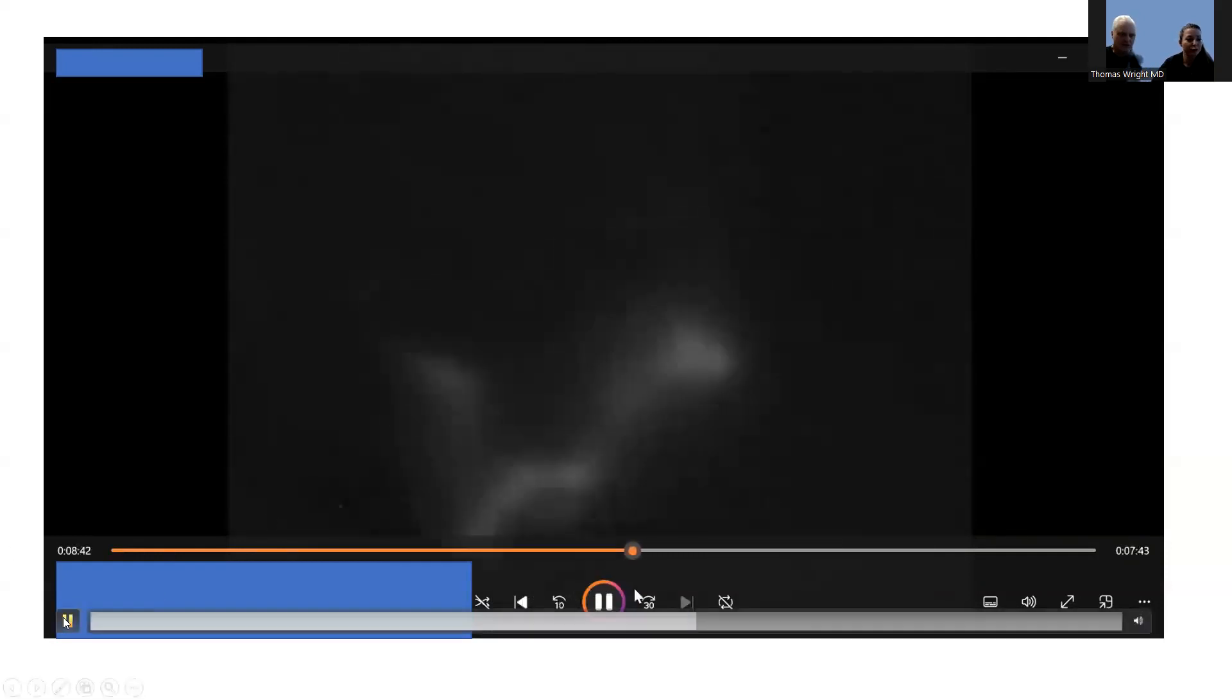Okay. I don't know if I'd say master, but thanks. So the first video I'm going to show you is actually sort of my process of before injecting. You can't quite see this image very well here, it's kind of a dark screen, but it'll get lighter here as you start to see. This is the top of that foot right here. You can see where I've injected in that first zone, that second zone, that third zone, and that fourth zone. We wanted to see all four zones on that uptake of that flow of that indocyanine green.